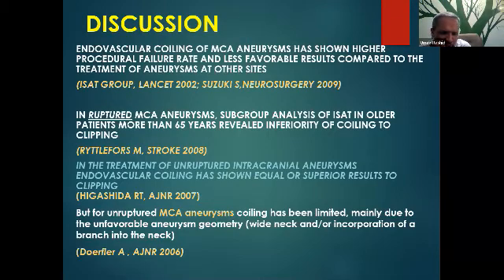But if you are properly doing the 3D, and in cases where you're confused, I do the simple planning in my practice, and I tell my colleagues, just forget it, don't do it. If you are confused, the patient is not a guinea pig. If you can't do it, then just quit and ask someone to do it if he's good at it, or you could go for surgery if it is possible. So this is my practice, and for that reason we have wonderful results with simple coiling.